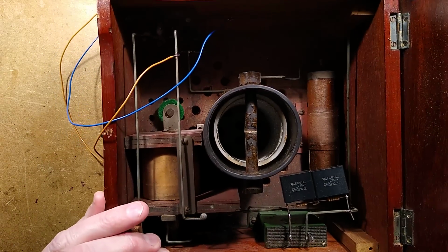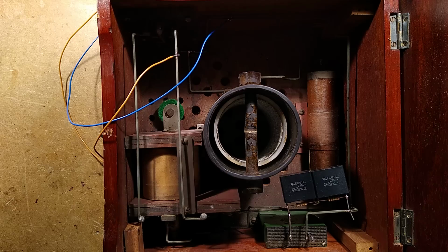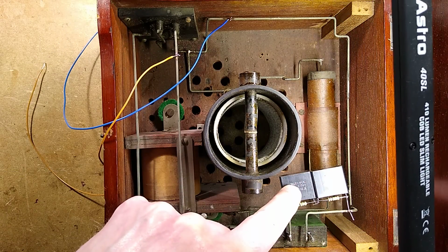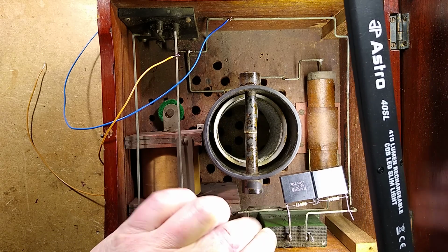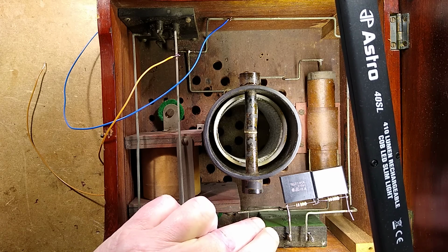And because this is not easy to illuminate with the bench lighting, because it's quite deep, I shall add extra illumination in the style of this light. Now, notice these very modern capacitors. The original green capacitor here is stamped on the side, 1 MF, 1000 volts AC. I think that's 1 microfarad.